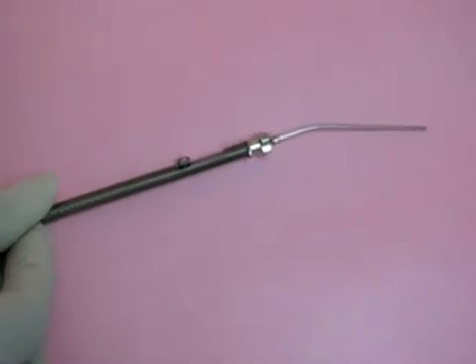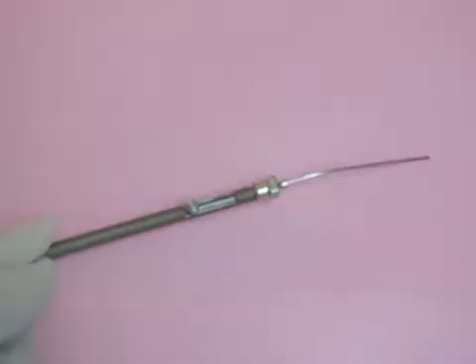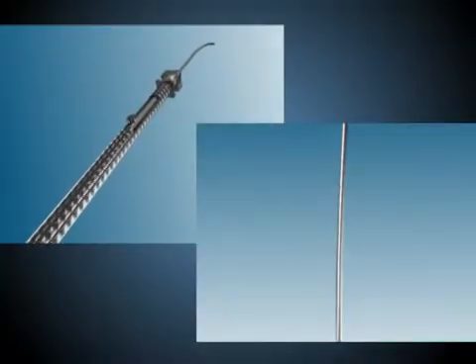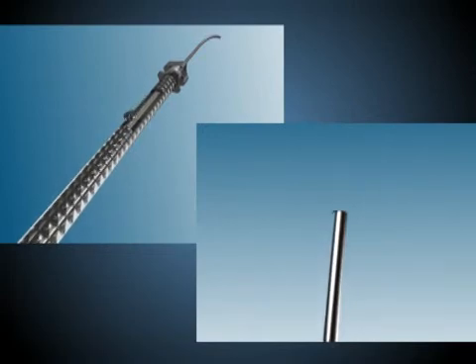There is a sliding member attached to the wire inside the main body. When the slider is moved using the knob, the wire slides in and out of the angulated tube.